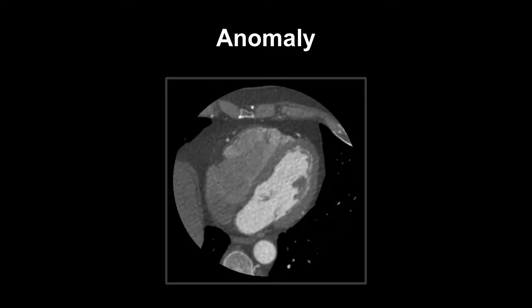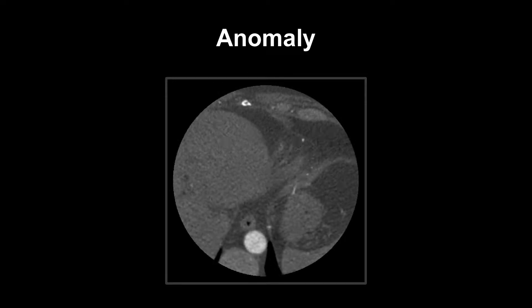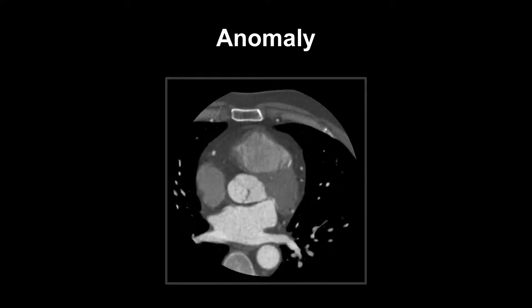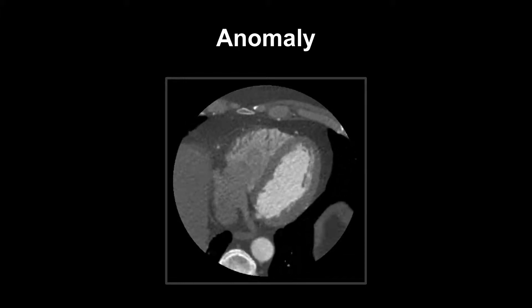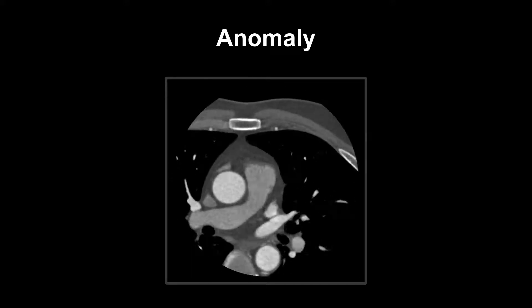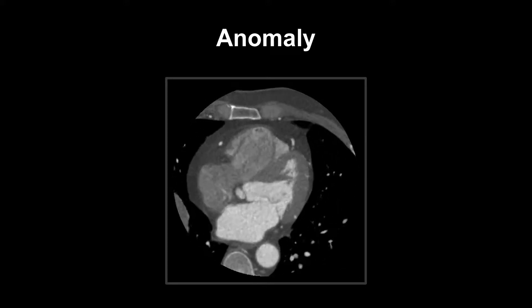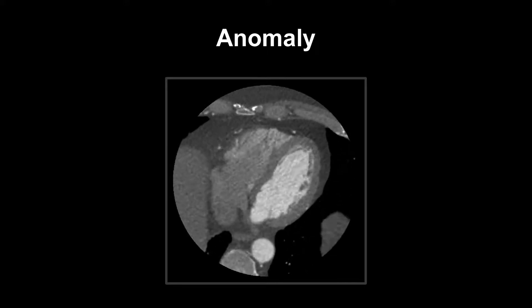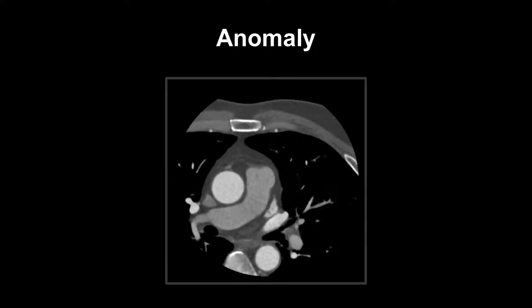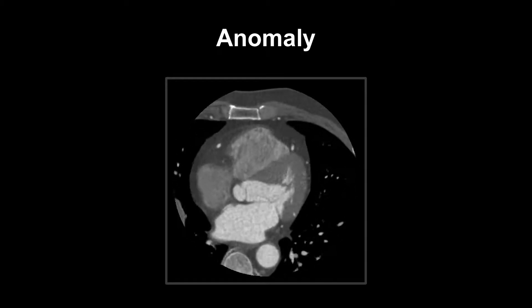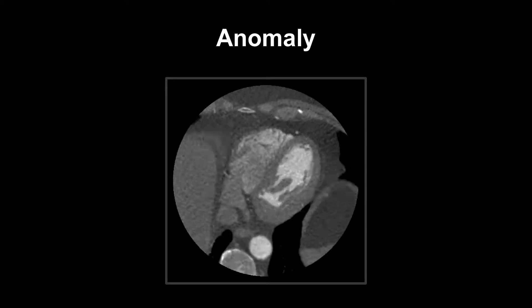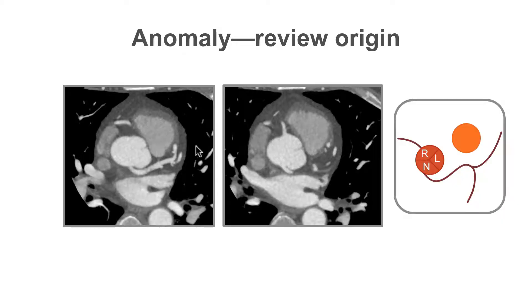What we would like you to do is look at the origins of the coronary arteries. Are you able to spot the anomaly? Look closely as to where the origins of the coronary arteries are. Does the right coronary artery emerge from the right coronary cusp? And does the left main stem emerge from the left coronary cusp? In this particular example, we can see that the left main stem arises from the non-coronary cusp. This is an example of an anomalous left main stem.